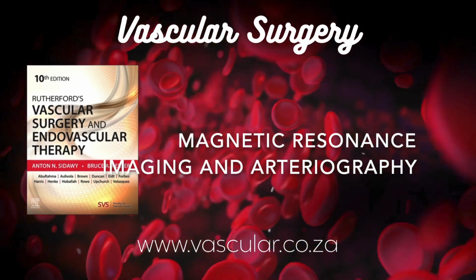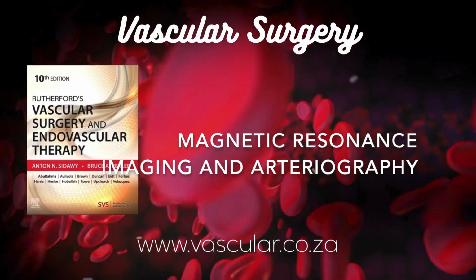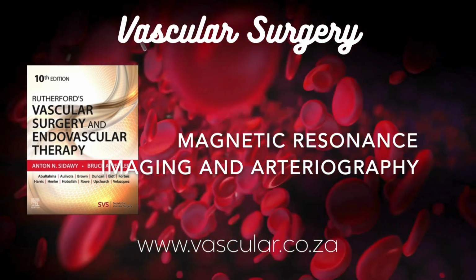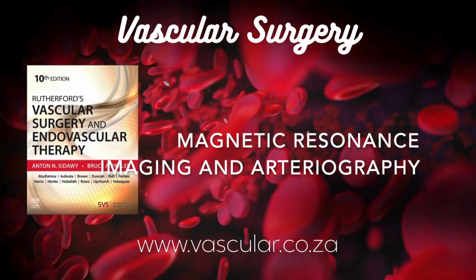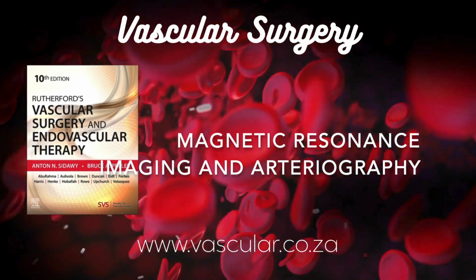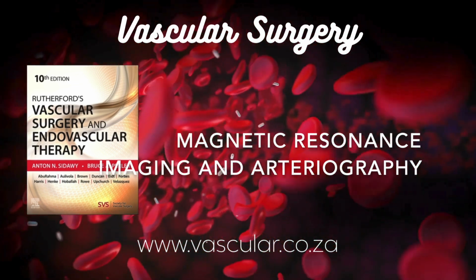And molecular imaging agents designed to stick only to specific plaque components are in development. So maybe one day predicting plaque rupture non-invasively. That's the long-term goal. And interestingly, some studies suggest MR angiography is getting pretty close to CT angiography in accurately assessing coronary artery stenosis too.